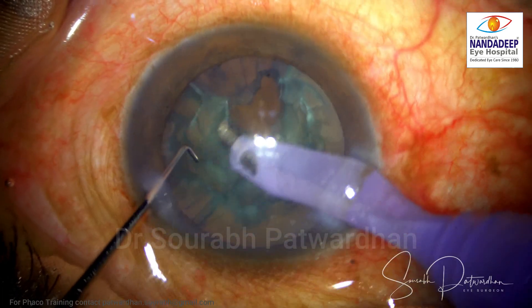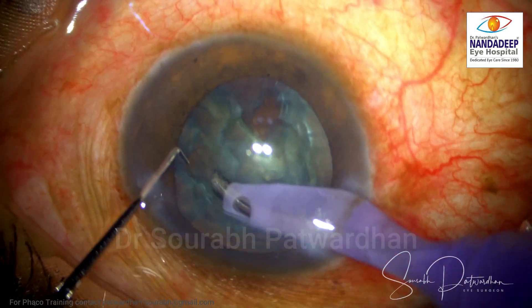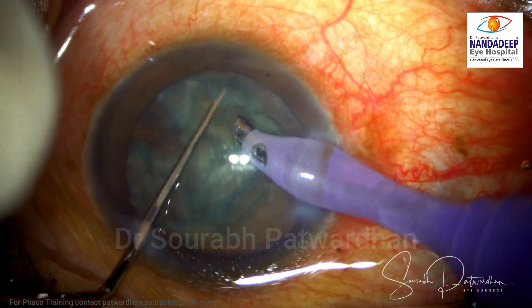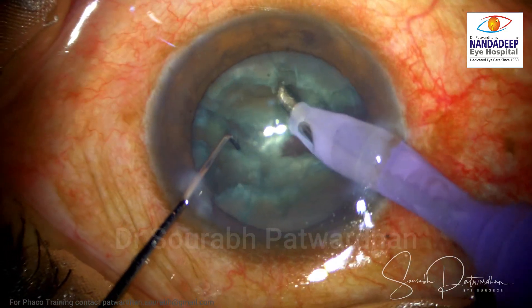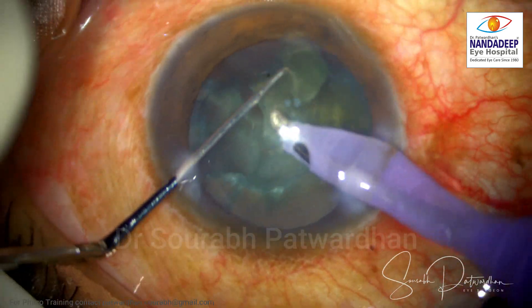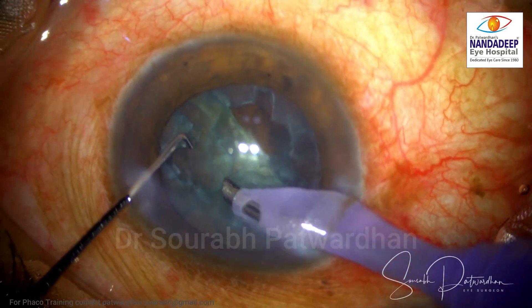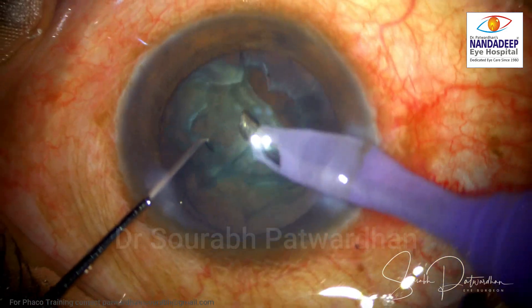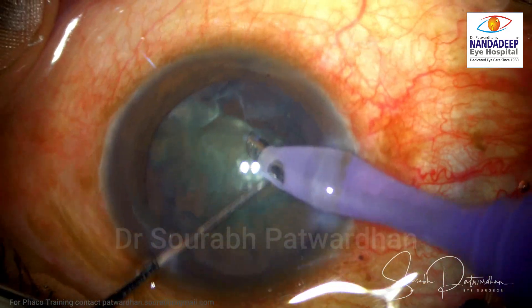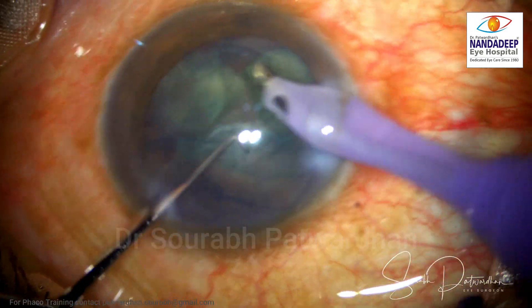This quadrant was stuck. I tried to apply some vacuum at the anterior end of this particular quadrant, but it was still adherent to another quadrant. So I decided to take out another quadrant from the other side, which was done quite easily. As you can see, even without hydrodissection, the nucleus is now rotating freely. This is what happens — even if you have not done proper hydrodissection, when you do trench divide, the fluid is going to cleave the space between the cortex and the capsule, and the nucleus will come out.